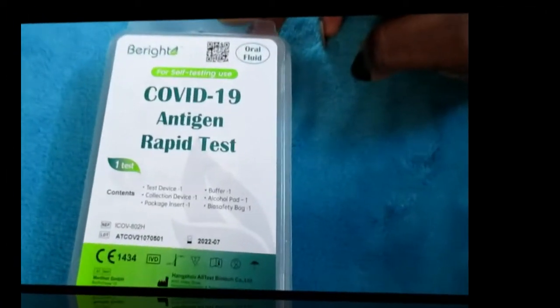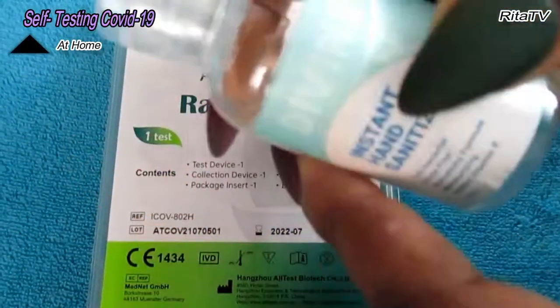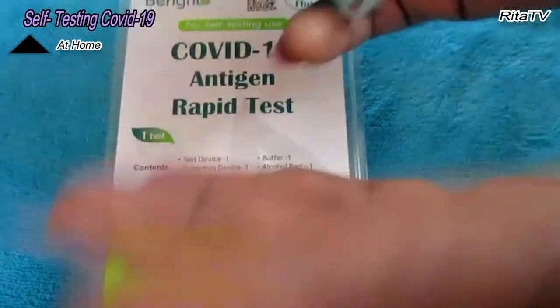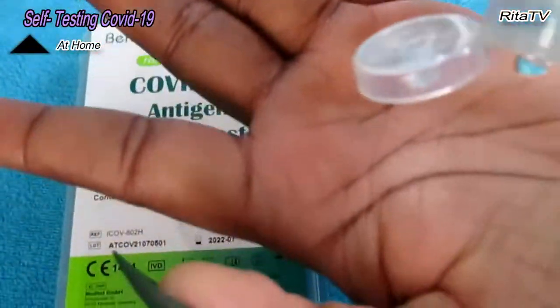Here is the COVID-19 kit. We're going to start the test now. First thing first, you have to sanitize your hands. You have to wash your hands, then sanitize them. I already washed my hands, so I'll be sanitizing before I start the test.